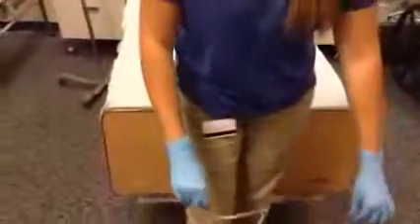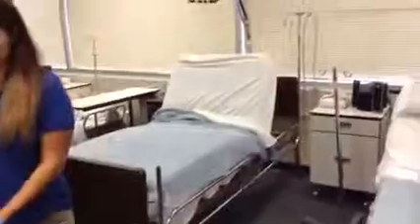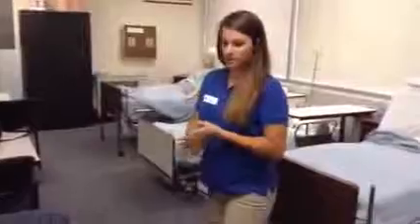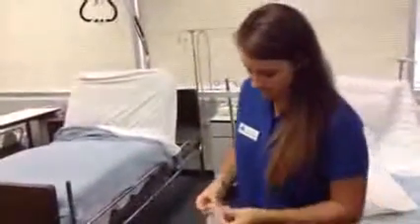Alright, Mr. Smith, I'm going to check with you in about 30 minutes, okay? I'm going to take my gloves off and wash my hands thoroughly. And then I'm going to make sure I get new gloves to apply when I go back into the patient's room. So now it's been 30 minutes. I'm going to go back to the patient's room. Hi, Mr. Smith. How are you feeling? I'm going to wash my hands one more time and apply gloves again.